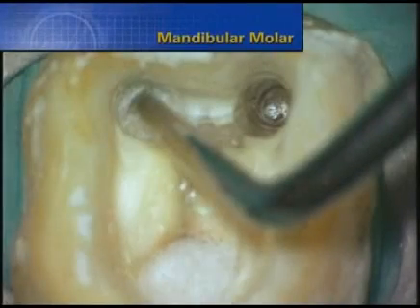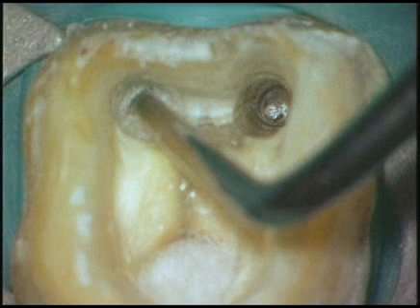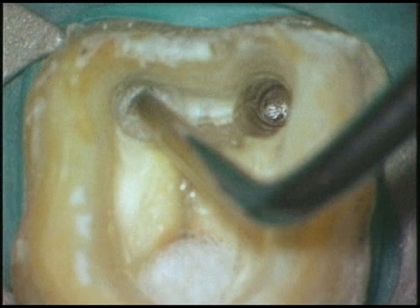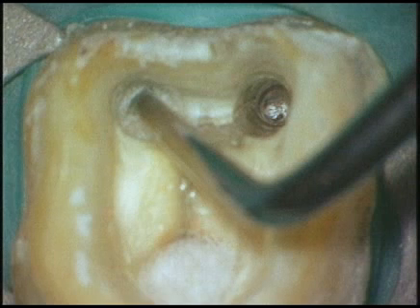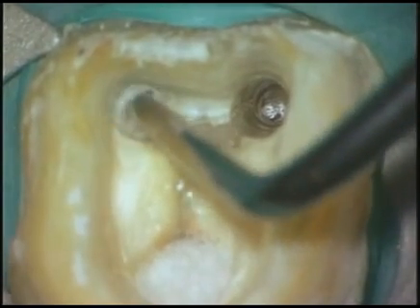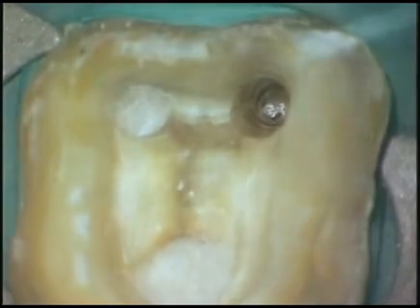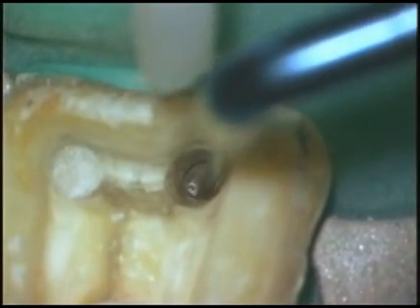Here's a mandibular molar we saw earlier in the show. Notice a broken file deep within the MB root. It's partially around the curve. During removal techniques, it is wise to place cotton pellets over any other exposed orifice to prevent the nuisance reentry of the fragment into another canal system. Great radicular access is critically essential to expose and visualize the obstruction.